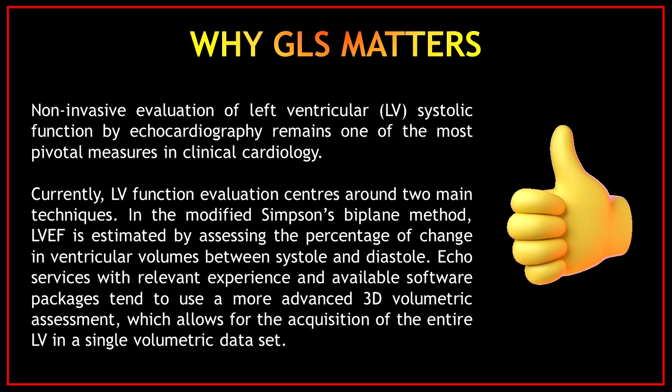One of the most important questions is, why GLS matters? Non-invasive evaluation of left ventricular systolic function by echocardiography remains one of the most pivotal measures in clinical cardiology.